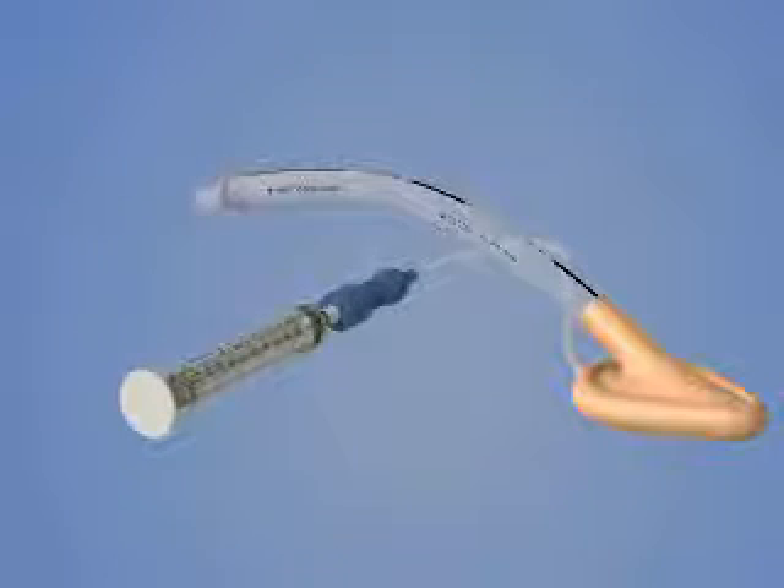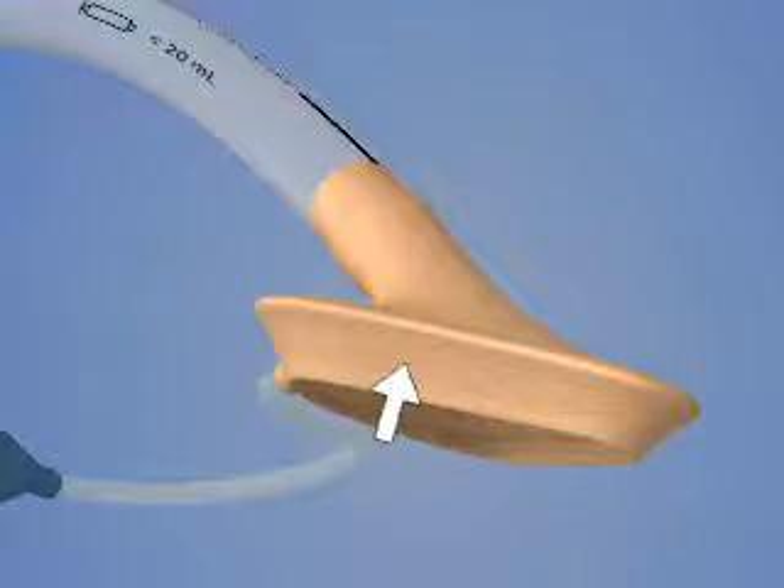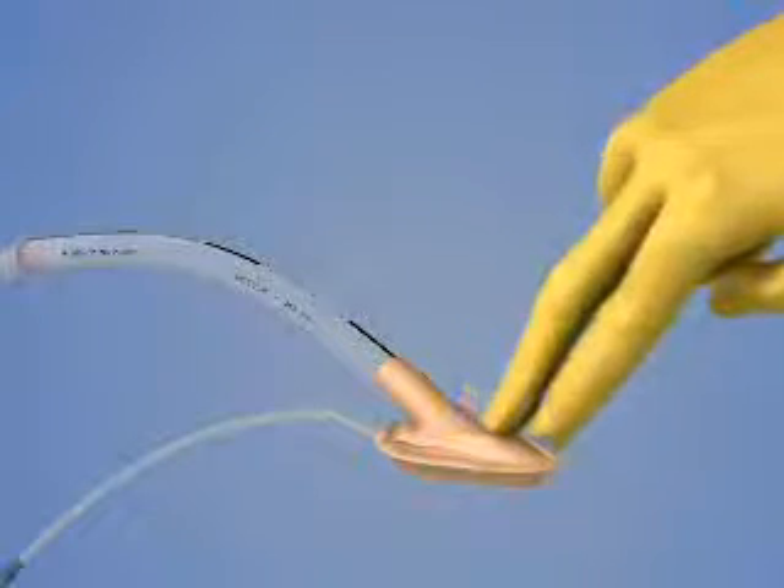Completely deflate the LMA cuff until it forms a smooth wedge shape without any wrinkles. Place a small amount of water-soluble lubricant on the LMA mask prior to insertion.